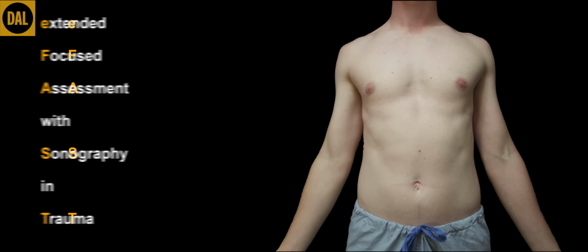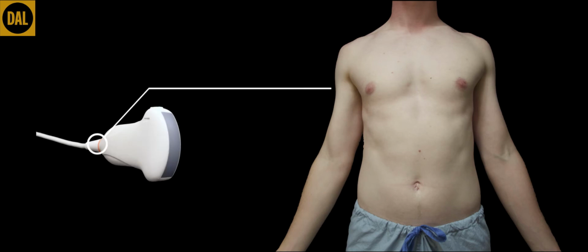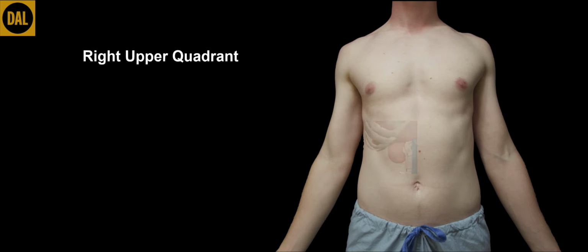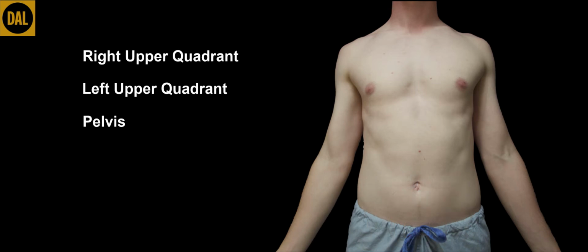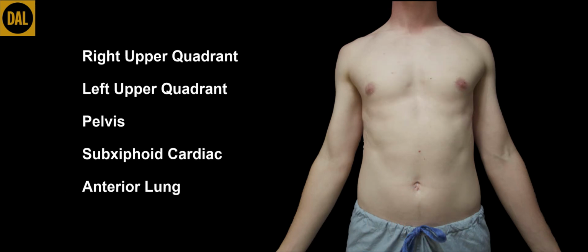In this scan, we will be doing the eFAST scan. eFAST stands for Extended Focused Assessment with Sonography in Trauma. For this scan, we will be using the low-frequency curvilinear transducer. We will be combining the right upper quadrant, left upper quadrant, pelvis, subxiphoid cardiac, and lung scan.